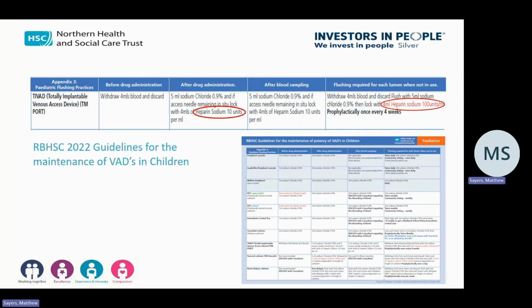So in both clinical areas, if you just look for that RBHSC guideline and just be checking with that whenever you're accessing. Do the nurses on the ward access it, or do we? We'll discuss that at the end, because that's a hot topic, but there can be a reliance on the doctors to think, well, that's okay, the girls will know how to do it. We'll speak of that at the end.